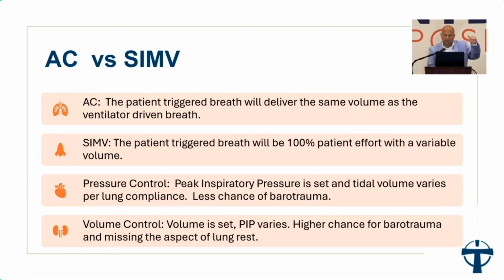When that pressure hits, you get whatever volume you get due to your lung compliance. And SIMV, or SIMV with pressure support, has the beauty that when the patient takes a breath between those 10 breaths a minute, they get their own tidal volume. All pressure support does is augment the spontaneous tidal volume, which helps the patients grow their lungs and get a little bit stronger.